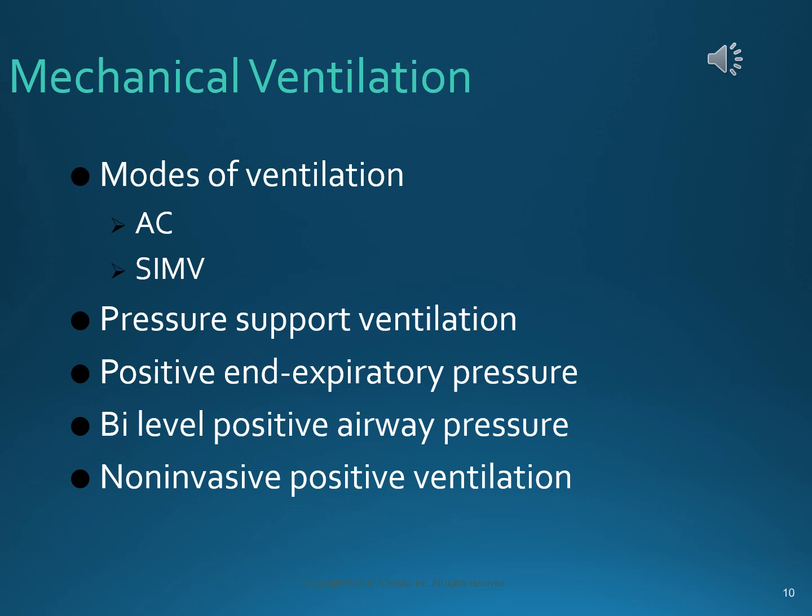You can have SIMV, which is synchronized intermittent mandatory ventilation. So it lets them breathe independently, but it also delivers a minimum number of breaths per minute, and it synchronizes to the patient's own ventilatory pattern. It's sort of a fancy assist control thing.